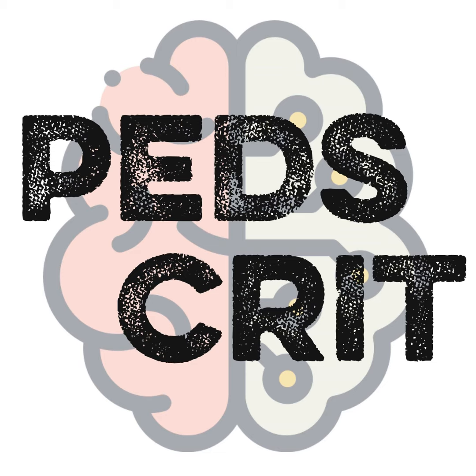Priya, a follow-up question that kind of goes into all of this. I had a patient early in my training who was VA cannulated peripherally in the lower extremity, and they actually had desaturation in their upper extremities, but they were fully saturated in the lower extremities, and I was told it was called Harlequin syndrome. I'd just like to know more about what's going on there and how we can possibly prevent that?